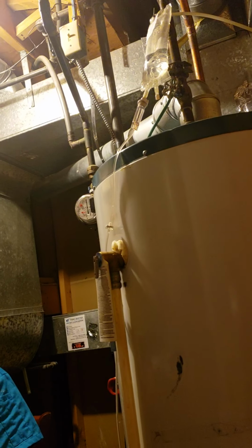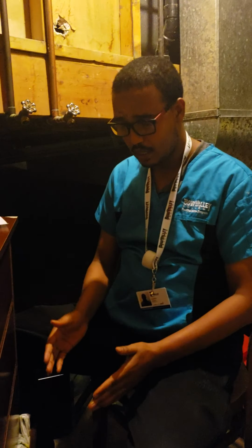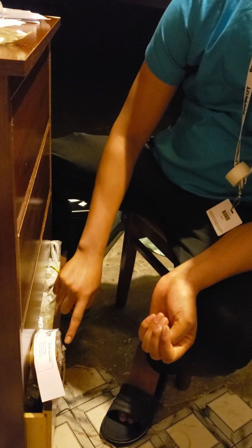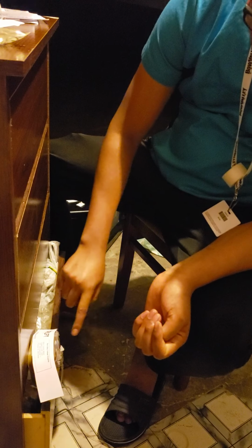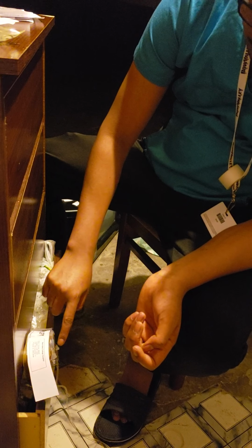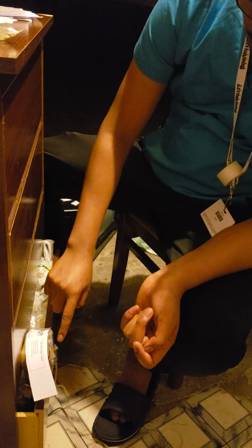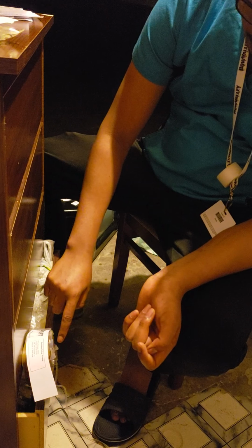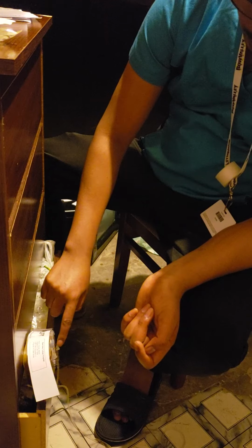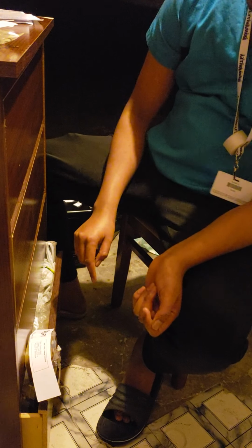I have to give privacy and move the bed to the working height, then assess my patient. I'm going to start assessing from the injection site for any pain. Do you feel any pain or tenderness? No. Is there any fluid or blood coming through? There is no blood coming through the IV line. There is no rash, no redness, no ecchymosis, so it is good.